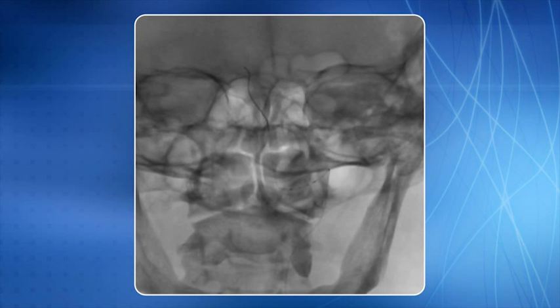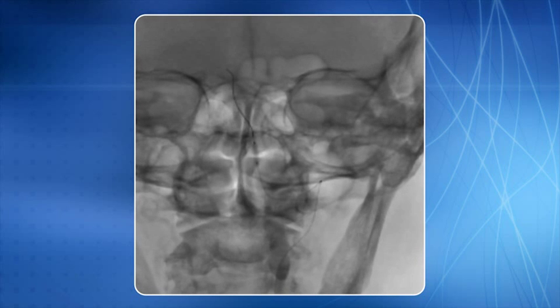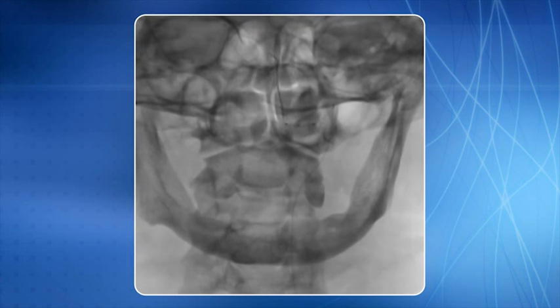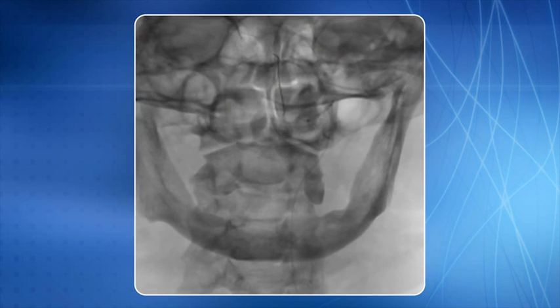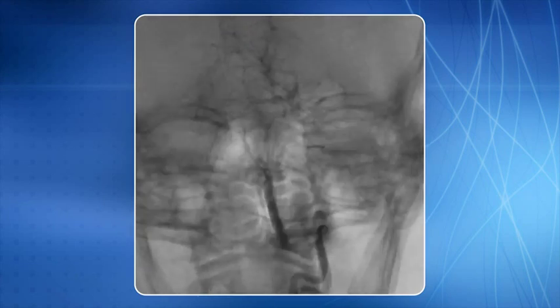A 2.5 millimeter PTCA catheter is negotiated through the curves of the vertebral artery into the lesion. Ballooning is in progress. A balloon expandable stent is then negotiated across the lesion. Stenting is in progress, and this is a good end result.